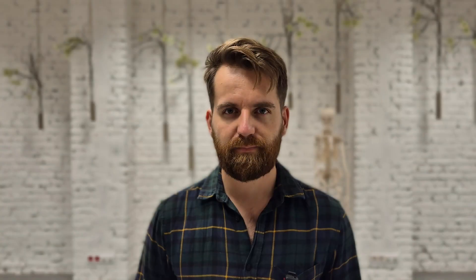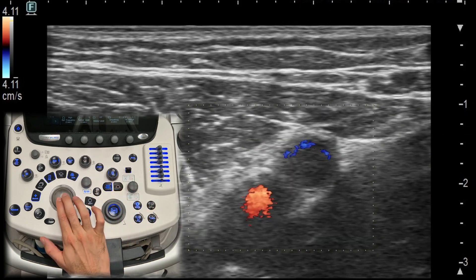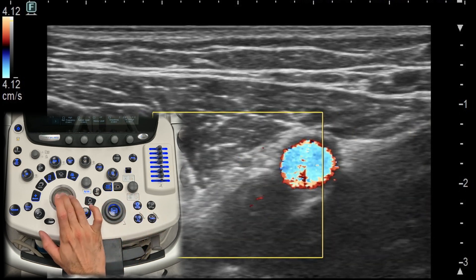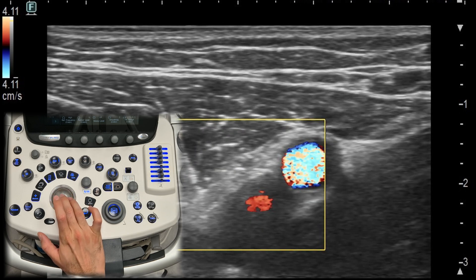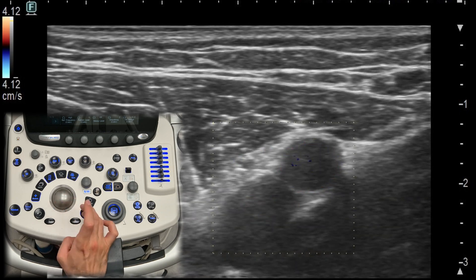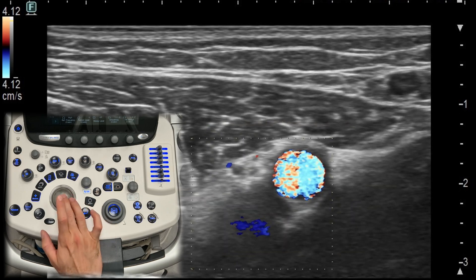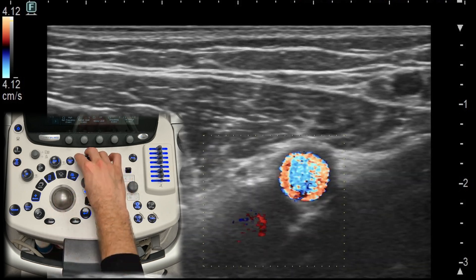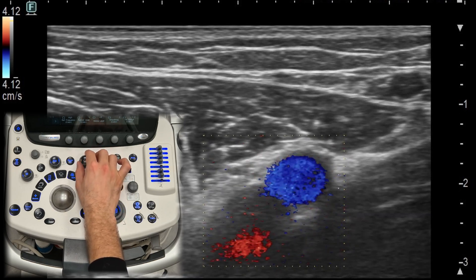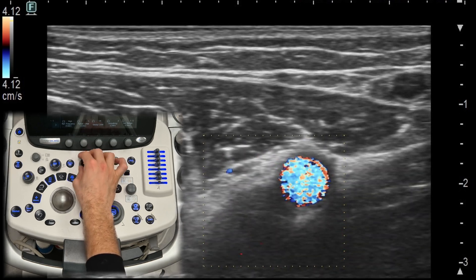Color Doppler. Color Doppler allows you to assess blood flow within a structure. It shows blood flow direction and velocity in real time, which can be especially useful for evaluating inflammation or vascular injuries. Remember to adjust your settings based on the area you are scanning to avoid artifacts. Turning the button to the right typically increases the sensitivity of the color Doppler, while turning it to the left typically decreases the sensitivity.